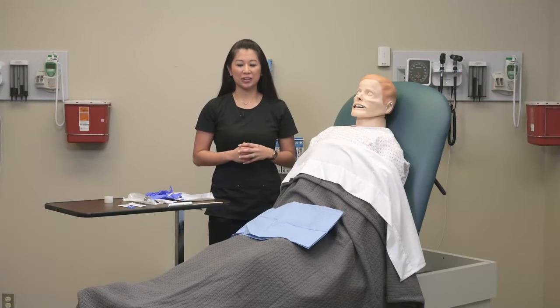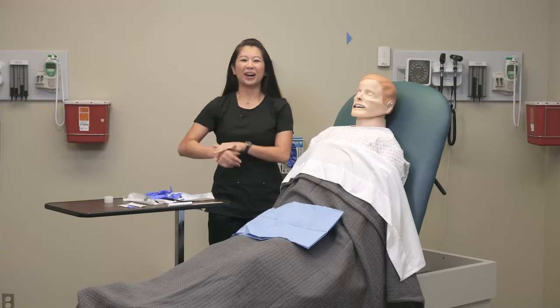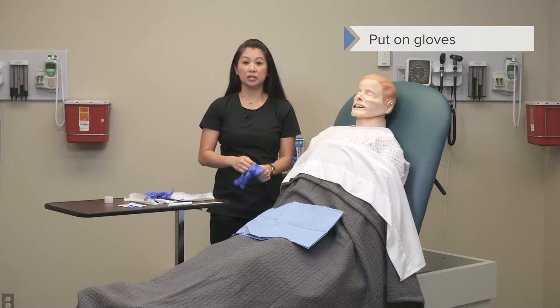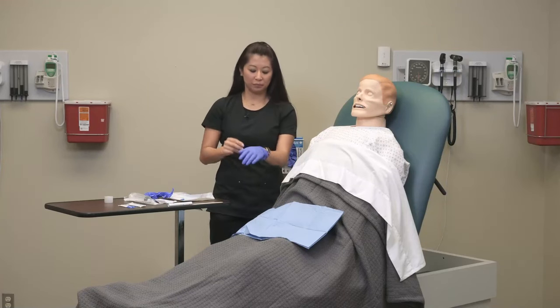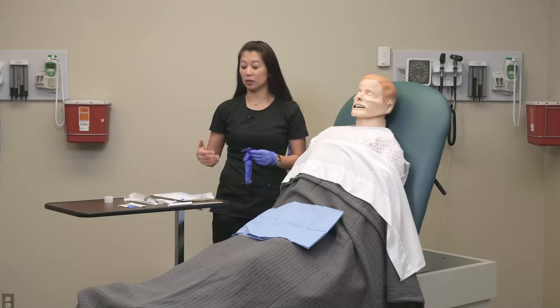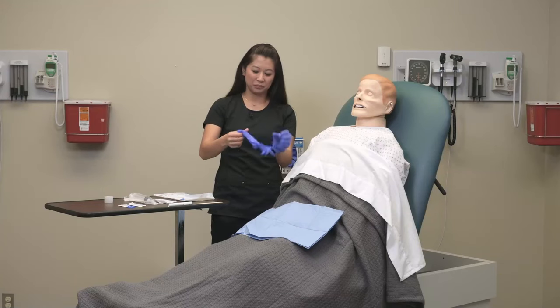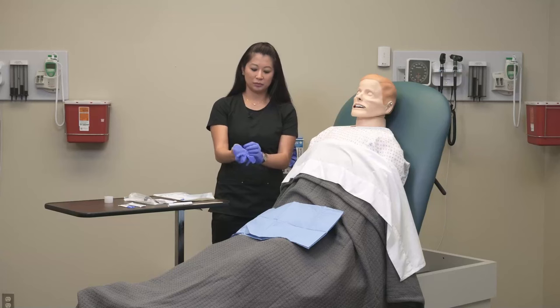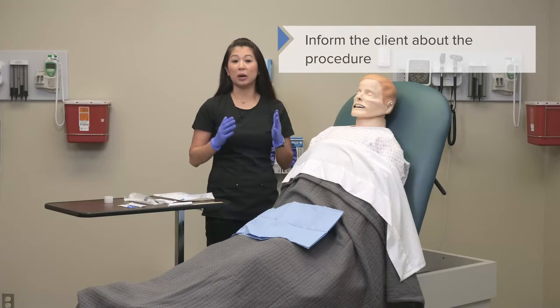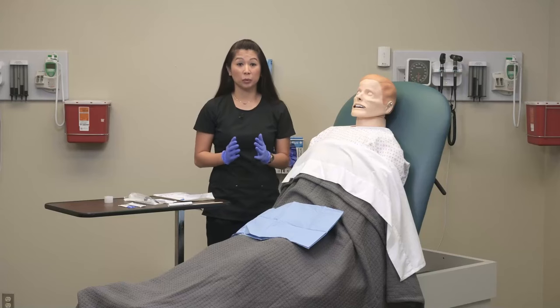Now I'm going to show you how to insert a nasogastric tube. Before we get started, I'm going to perform my hand hygiene and put on my gloves. One thing to note about nasogastric tube insertion: because we're going through the GI tract, this is not a sterile procedure. The GI tract is not a sterile environment, so this is helpful for you to know as a student. At this point, I've already explained the procedure to my patient and let them know that inserting a nasogastric tube is not the most comfortable procedure — so be really honest about this when you approach your client.